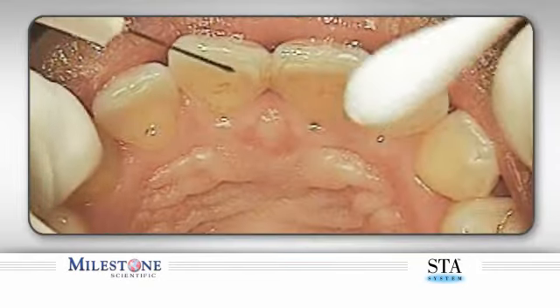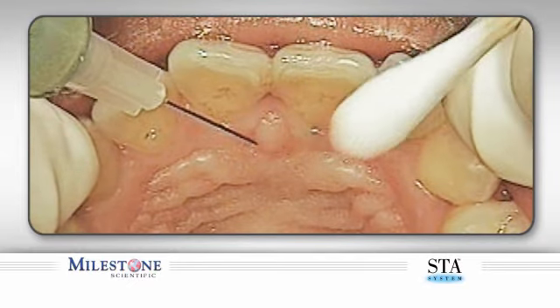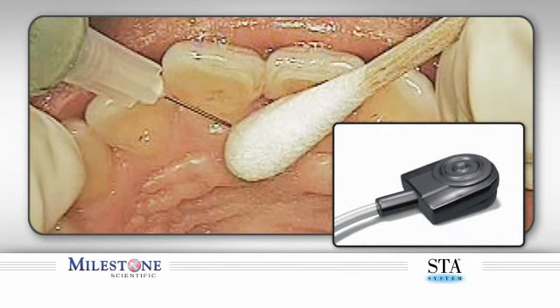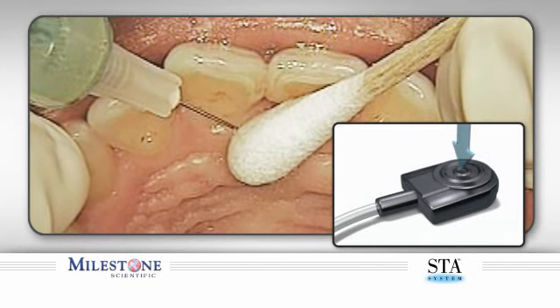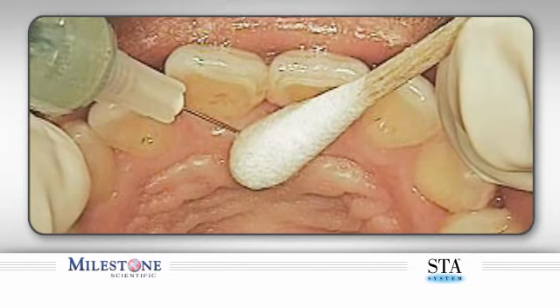We will now show a clinical example of the P-ASA injection being performed. You can see the needle is applied to the surface of the palate, followed by the placement of a cotton applicator. The flow of anesthetic is begun by initiating the STA cruise control. Once the needle bevel enters the tissue, pause forward movement for an additional 4 to 5 beeps before advancing again.